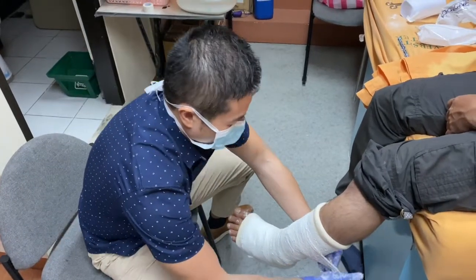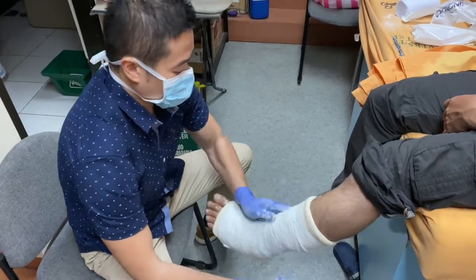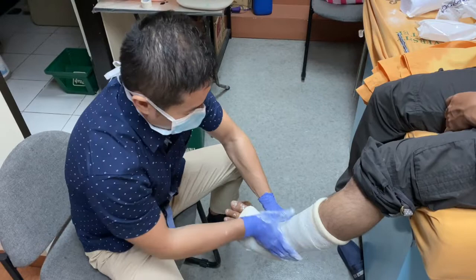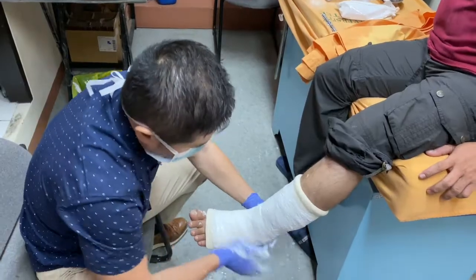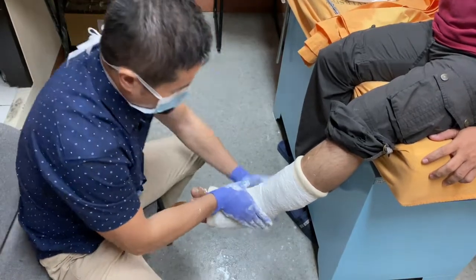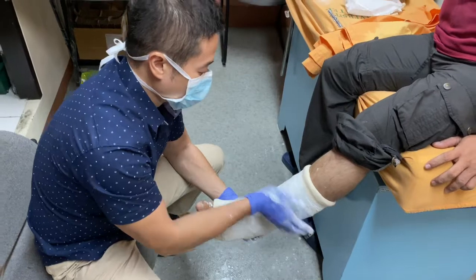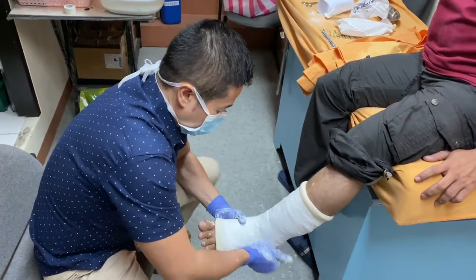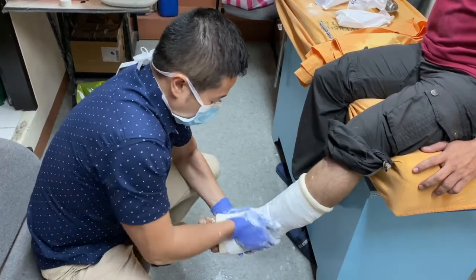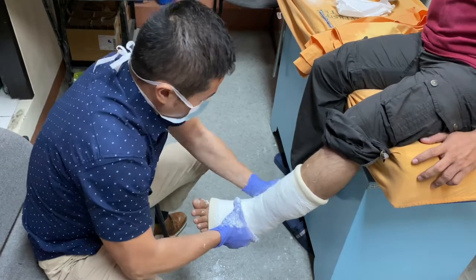For lower extremities, there should be around 13 to 15 layers of cast applied. We will apply another roll to achieve the required thickness.